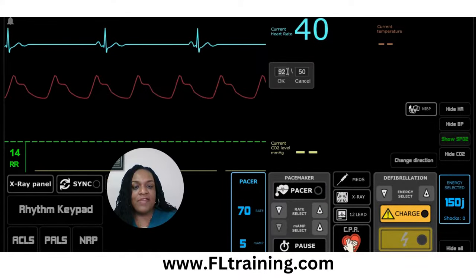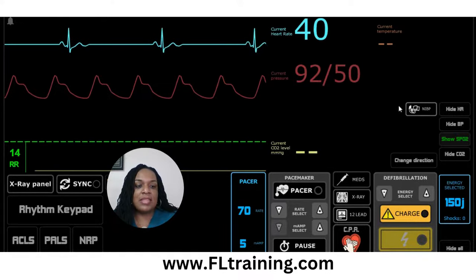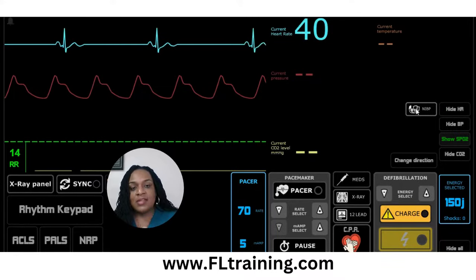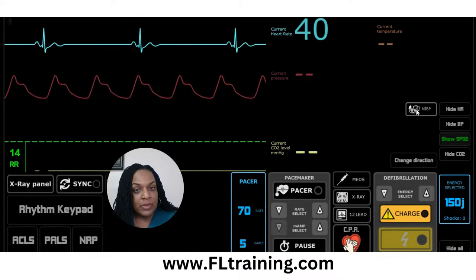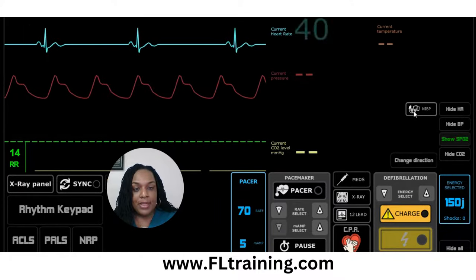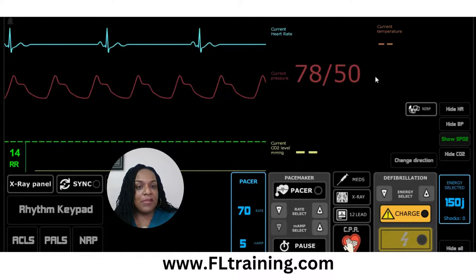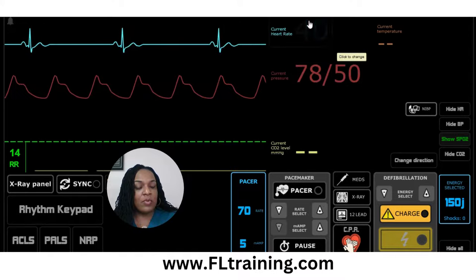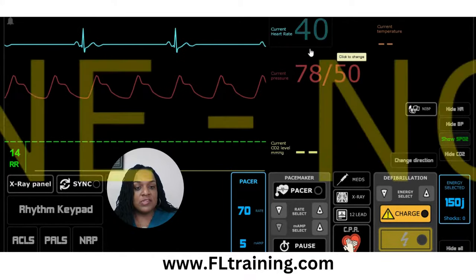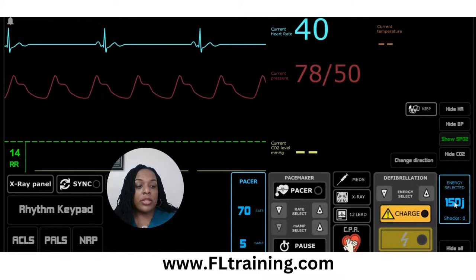After we give the atropine, if we do not have the desired effect when we go back and reassess, we want to be thinking about secondary treatment. For me, when I'm trying to prevent an arrest, my secondary treatment is going to be energy. It's going to take a while before infusions come from pharmacy, so I won't have dopamine or epi IV drip right now. The patient's blood pressure is 78 over 50 and my goal is to prevent an arrest. Since atropine didn't work the first time, I'm going to go with my transcutaneous pacemaker function.